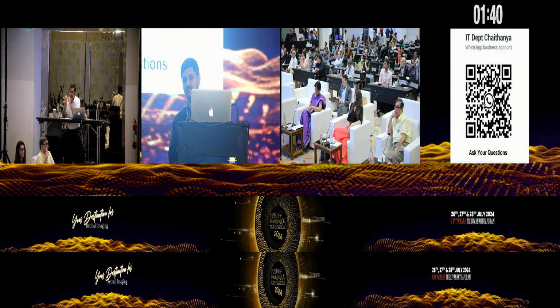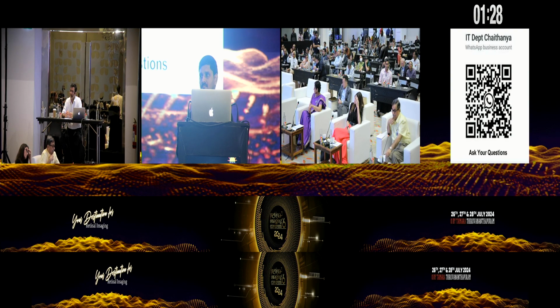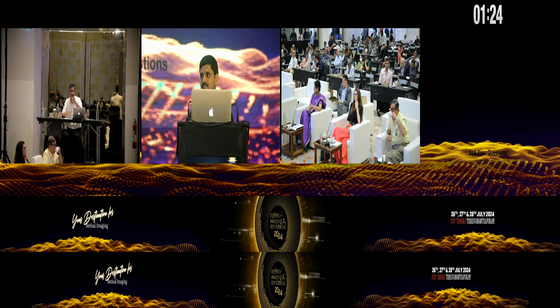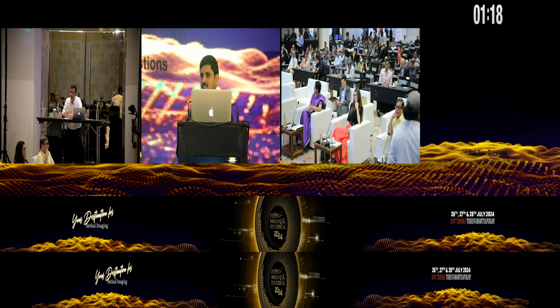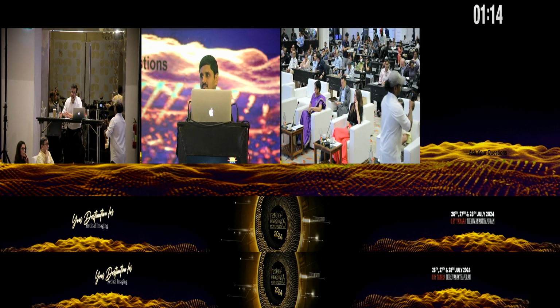I personally feel that it is important to look for if there is any SHRM, because I think that tolerating type 1 type of fluid is still acceptable. Having a type 2 where Pradeep nicely showed that there was a breach and which led to CNV, those are the cases where you really want to start treating. But my usual approach if I see a type 1 with a subretinal fluid, just sit on it and let's see how it does.